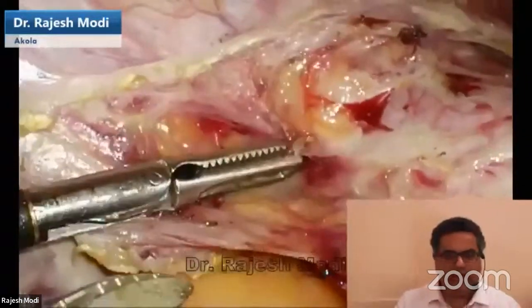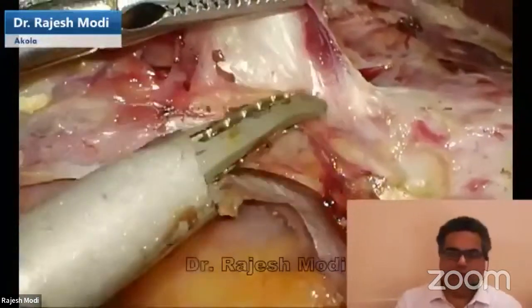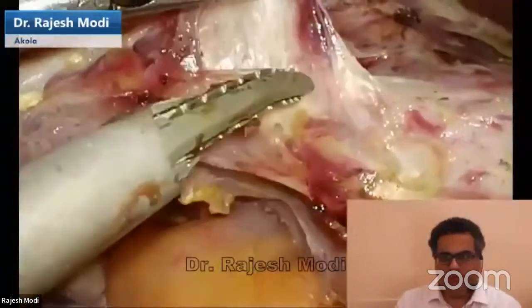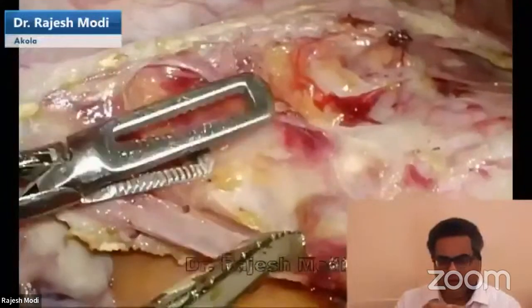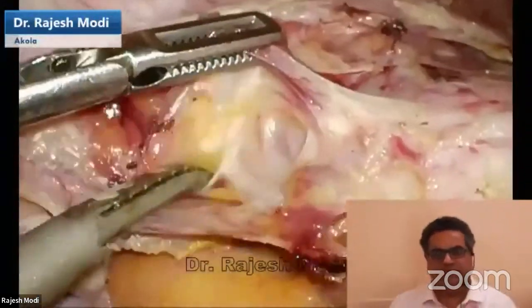Get into the habit of dissecting the pillar down, pushing the pillar down. The moment you push the pillar down, you will notice that the bladder, the uterine, the transverse part of the uterine starts cooperating with you in every single surgery.